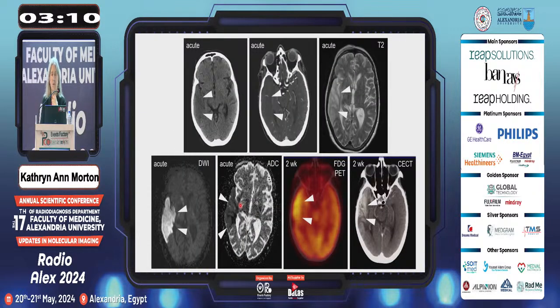This is a patient who presented to the emergency room with a stroke. On physical exam, they found a vulvar carcinoma that was quite large, and her workup focused primarily on her stroke initially. This is the non-contrast CT, which shows hypoattenuation, and then the contrast CT shows a lack of perfusion to this area. Her MRI shows edema on T2, and then your diffusion-weighted imaging shows characteristics of an acute stroke.